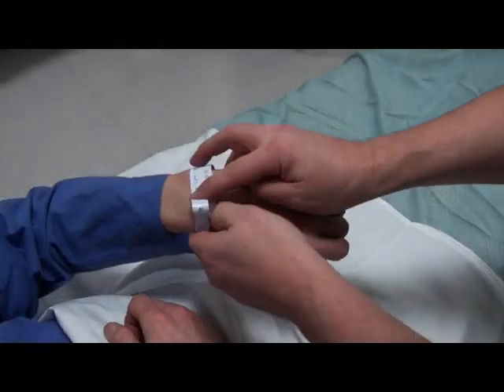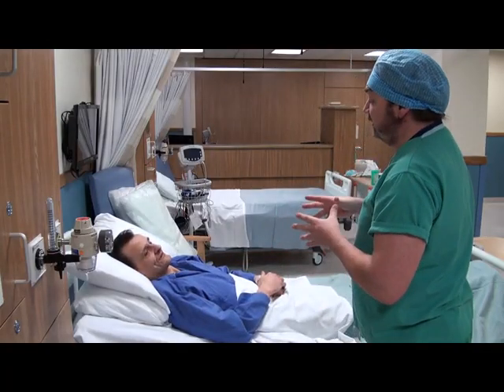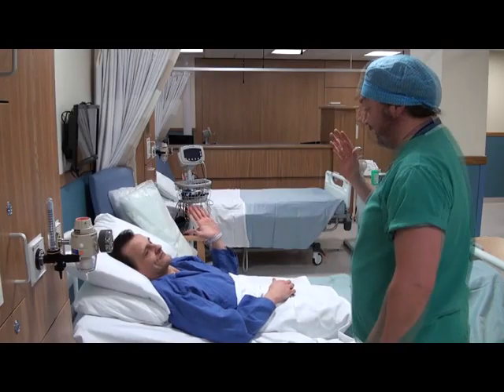Practitioners should give patients a reassuring, detailed explanation of the insertion procedure. Verify the patient's details by checking the notes and ID bracelet and check for any allergies. It is beneficial to agree a signal that the patient can use if the procedure becomes unpleasant and they wish it to stop. Ensure the patient knows exactly what the procedure entails.